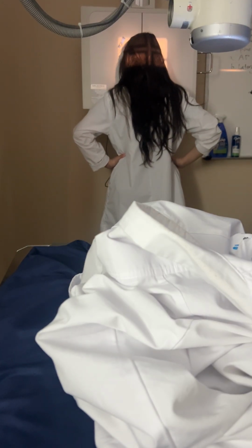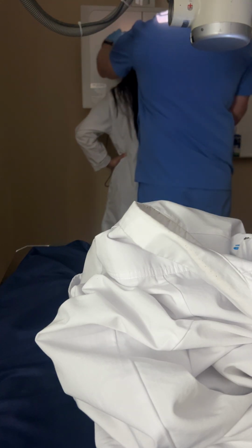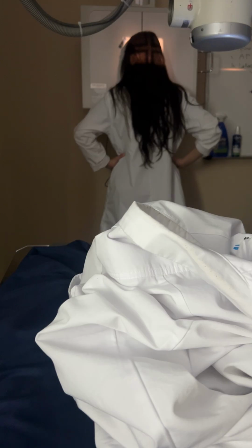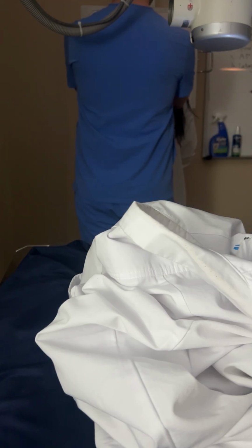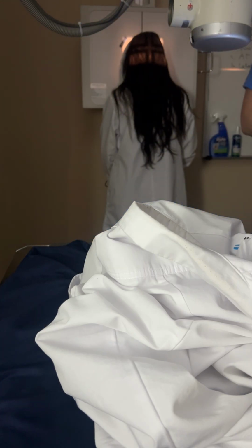What's your CR centering for that? Mid-sagittal, eye line with IR, nose, forehead. CR exits through the nasion, lined up with the EAM. Same thing as the last one. Same thing. We're just going to maybe collimate a little more so we can increase the contrast on her facial bones, okay? The first one you did was skull. This is cranium, or sorry, this is facial bones, yes. Okay. We're done with cranium. We're moving on to facial bones now, okay?